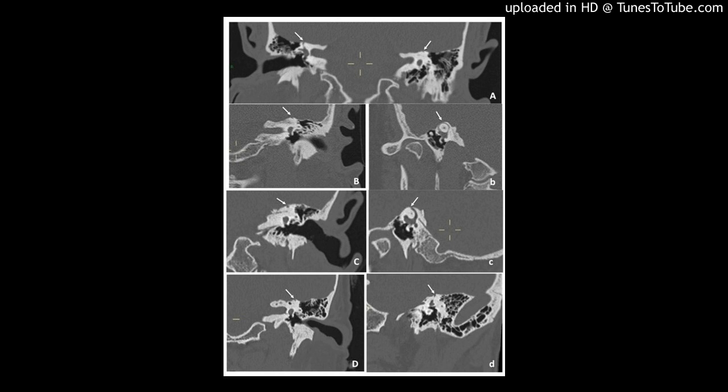The blue lining of the semicircular canal is better and safer performed with a 2 to 3 mm diamond burr under thorough irrigation to avoid high temperatures and thermal damage to the inner ear. Figure 5. The anterior aspect of the superior semicircular canal is gradually blue-lined, A, until the end ostium is visible, white arrow, B. The same process is followed for the posterior aspect of the superior canal, dashed arrow, C.